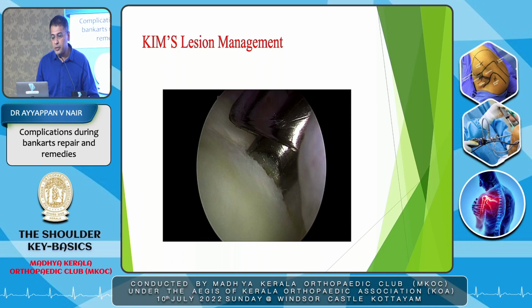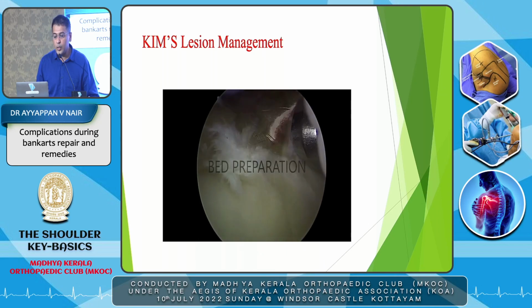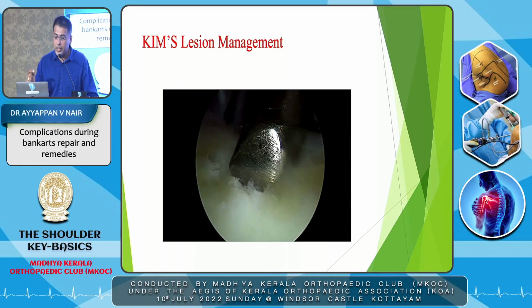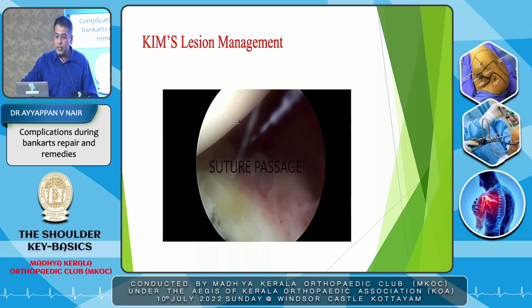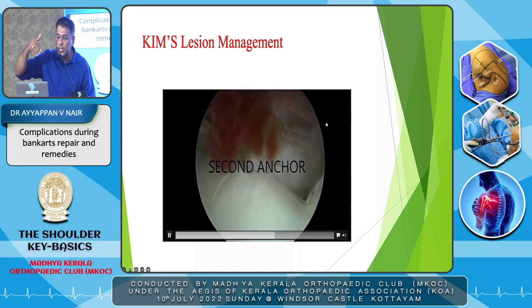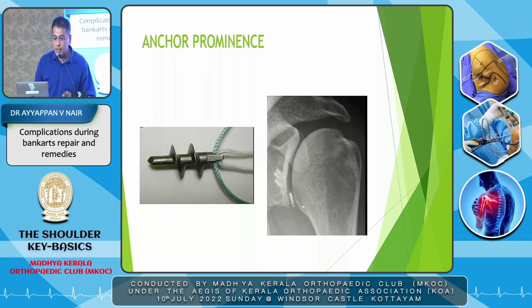And Dr. Harish mentioned about the Kim's lesion. Kim's lesion is a concealed lesion in the posterior labrum. So again, you elevate it. Here, one tip I would suggest is, if there is a posterior labrum, I'm just finishing in just a few seconds. The difficulty would be to get an anchor in that place. A high posterior, that means, okay, it should be a little more here. The posterior, it should be higher on the capsule to get access for anchor placement as well as repair. And hardware complications, it's been mentioned that, okay, avoid metals, avoid anything solid inside is always better.